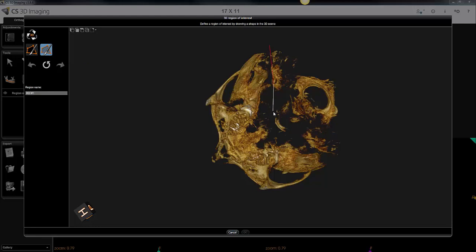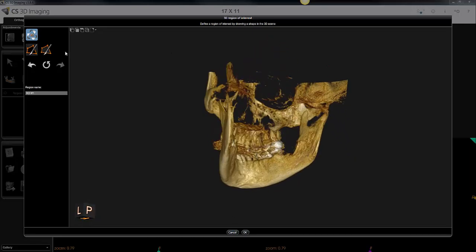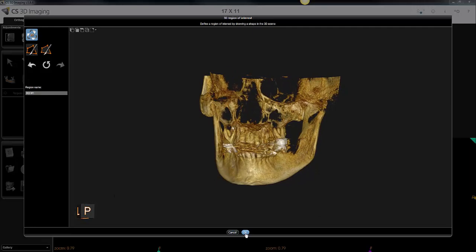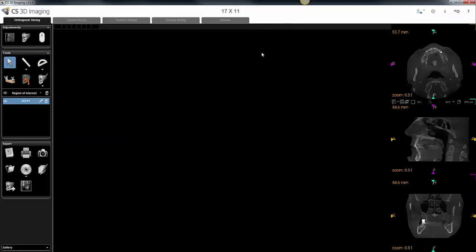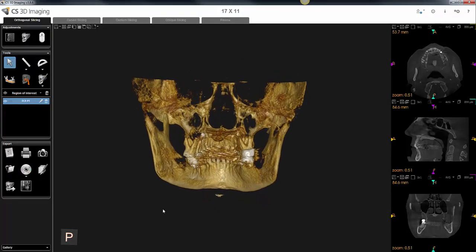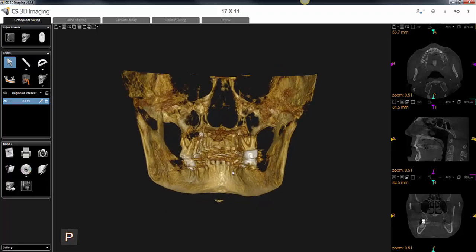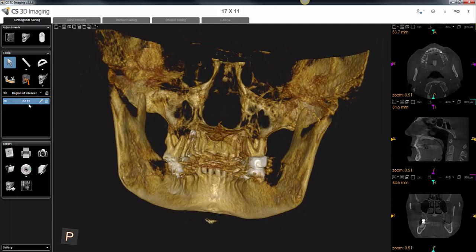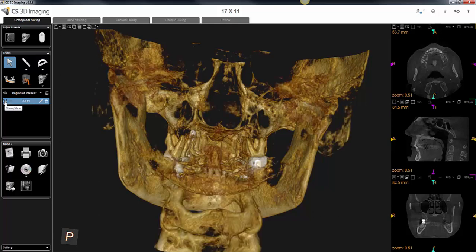So basically you're going to draw with a series of left clicks a polyline and enclose it to either preserve what's inside the polyline or preserve what's outside the polyline. Double click when you're finished and everything inside that line will be — it's not removed or deleted, it's just hidden. When we hit OK, you'll see that portion is gone. You'll be able to visualize looking posterior to anterior without the spine being in the way. That region of interest is displayed over here where we can show or hide it.